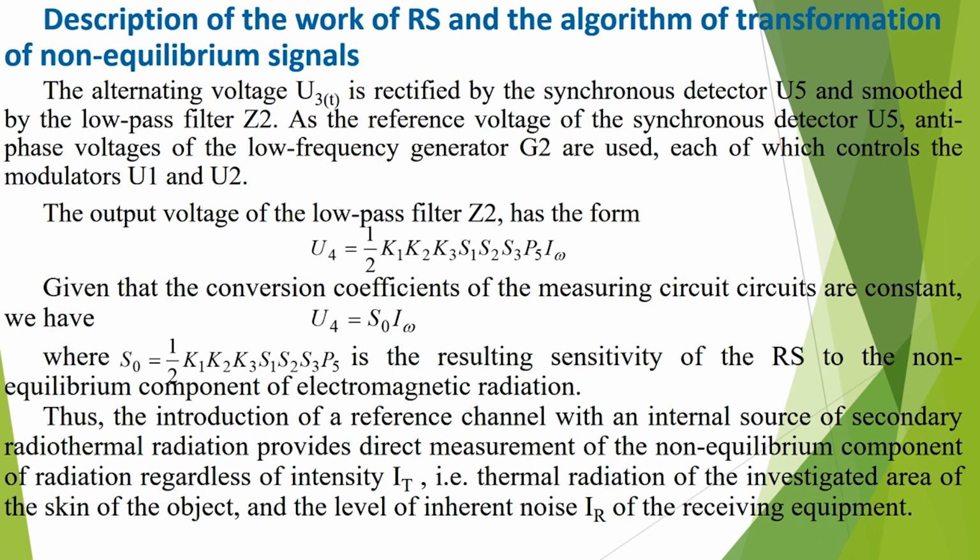And thus, the introduction of the reference channel with the internal source of secondary radiothermal radiation provides direct measurement of the non-equilibrium component of radiation, regardless of the intensity IT of thermal radiation of the investigated area of the skin of the object and the level of inherent noise IR of the receiving equipment.